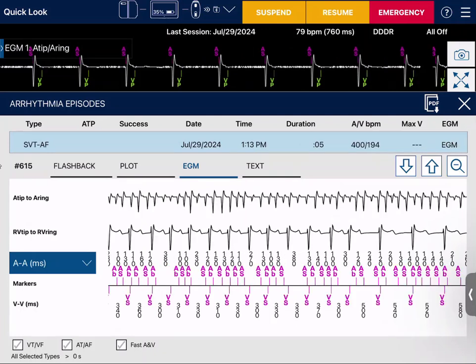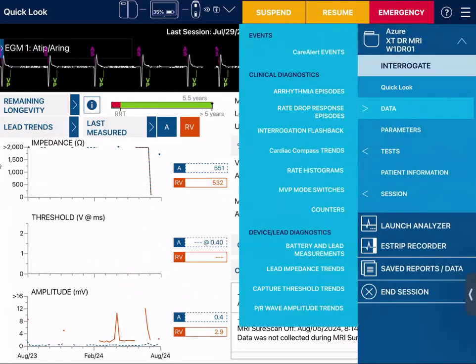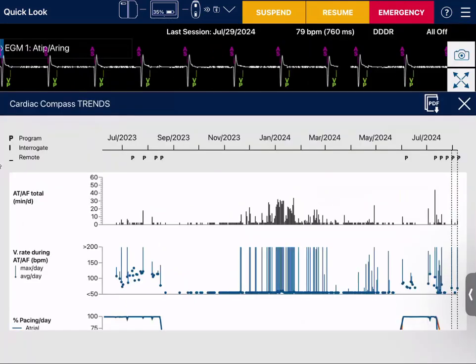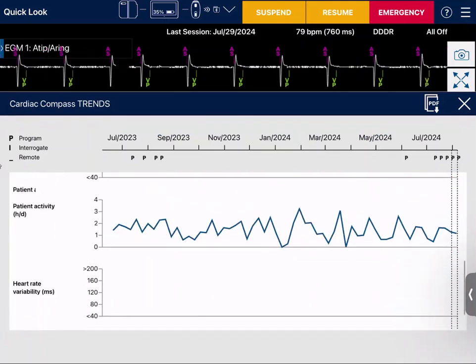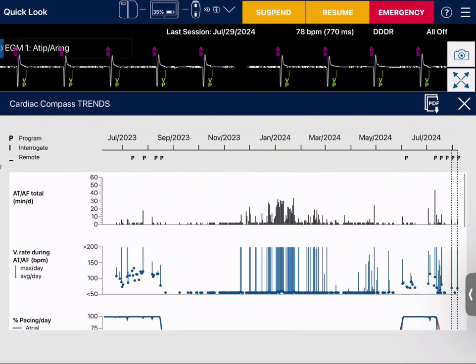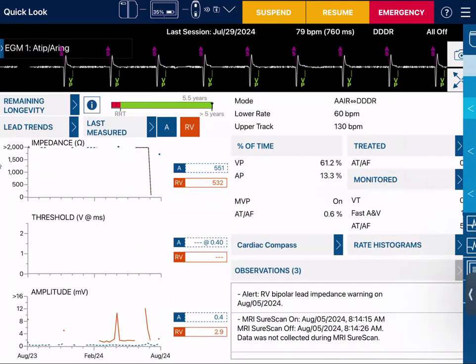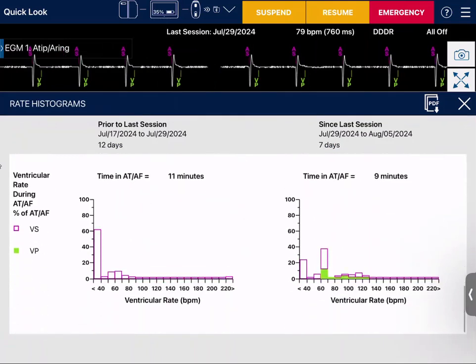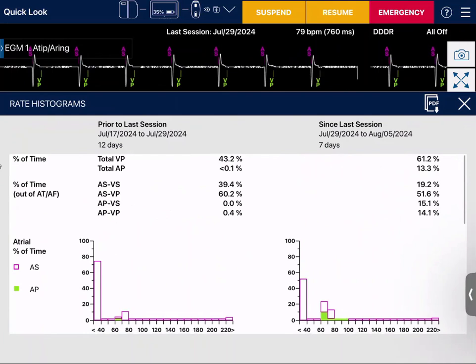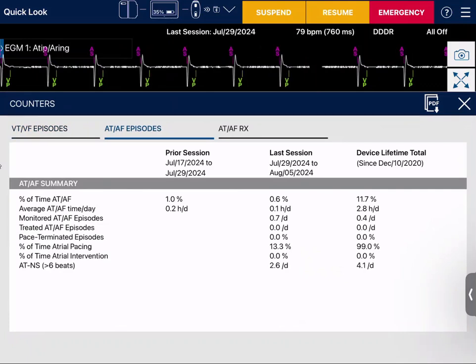From there I can look at my cardiac compass trends — ATF burden, patient activity, heart rate variability, and pacing percentages. I can also look at rate histograms to see if there's a good rate distribution, and check counters to see PVC burden and ATF episodes for the prior session and last session.